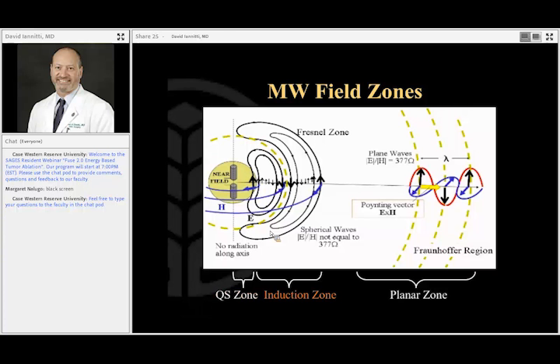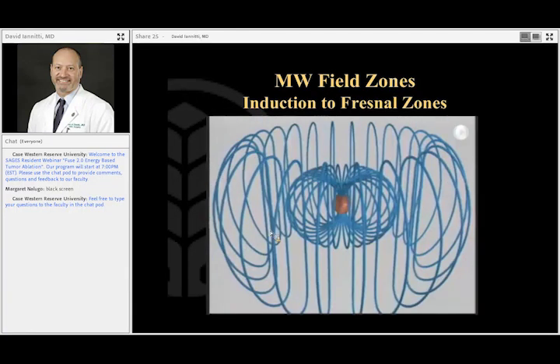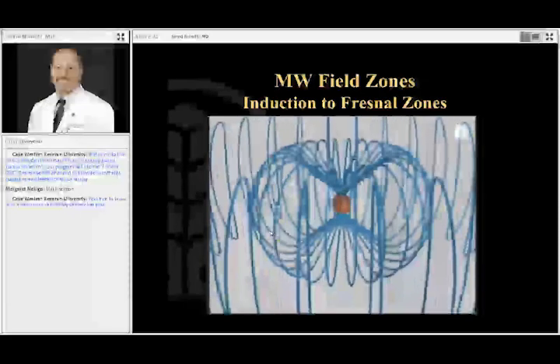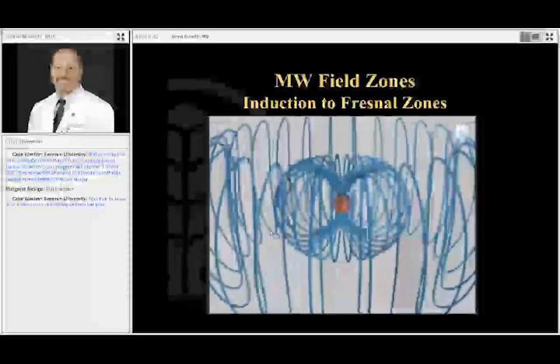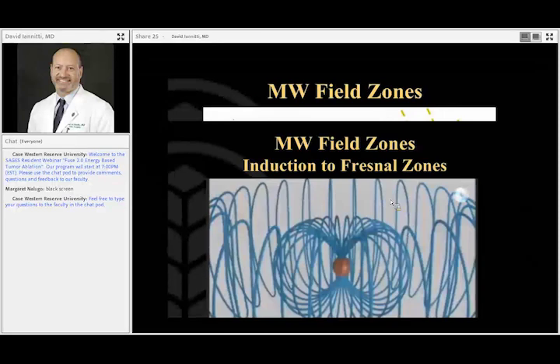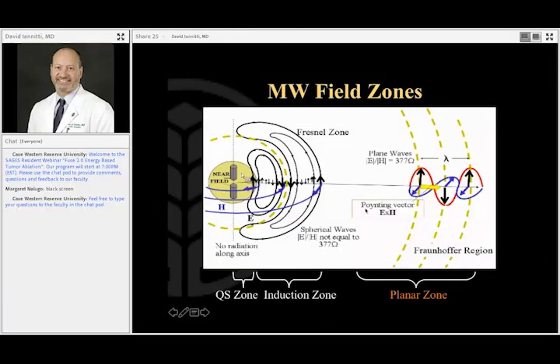But the wave is not going to be a planar wave adjacent to the antenna. You're actually creating spherical waves off the antenna, and as these spherical waves travel out, they don't lose energy. They don't lose their energy until they convert over to planar waves. So depending on the frequency, but clinically for the frequencies that we use, about 2 centimeters off of that radiating tip is where you transition from a spherical wave to a planar wave. And then when you get to a planar wave, the energy falls off at 1 over d squared.